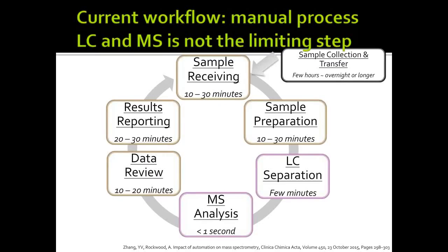All right, so this is the current typical workflow of a manual mass spec assay. Here, LC and mass spec is actually not the limiting step, and I'll show you why. When the sample comes in, it takes about a few hours or even overnight from the sample to get here.